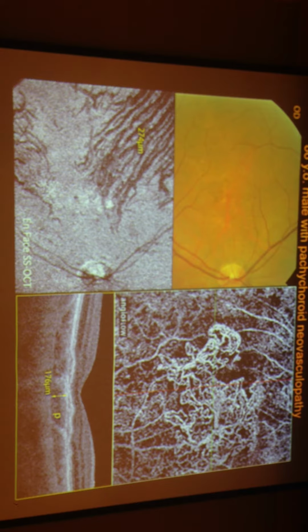So you have to do a long-term follow-up study to see all these patients, whether they develop all 4 stages with time. So it's difficult because now we are just seeing patients at different stages. And is the choroid equally thickened in both the eyes? Most of the time, if the patient has a bilateral disease, the choroid is thickened equally in both eyes.